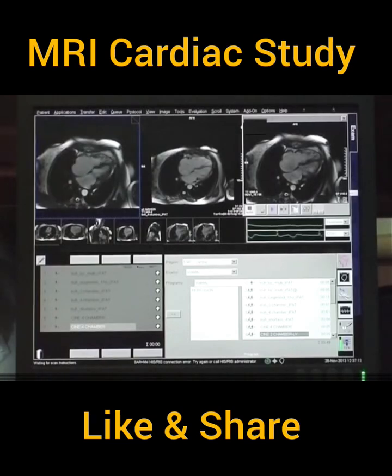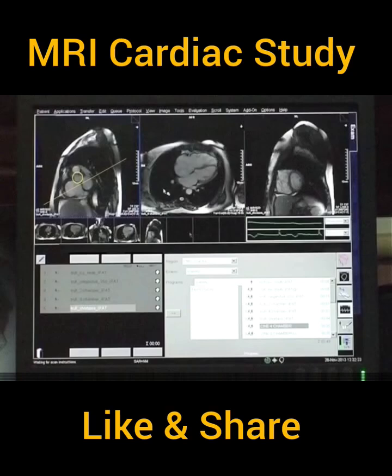While planning on the short axis view at the basal level, care must be taken not to include the aorta, otherwise a five-chamber view will be obtained where the aorta is also visualized. Note that the yellow circle represents the aorta and the yellow line represents the planning line. The planning line touches the wall of the aorta but does not pass through it.